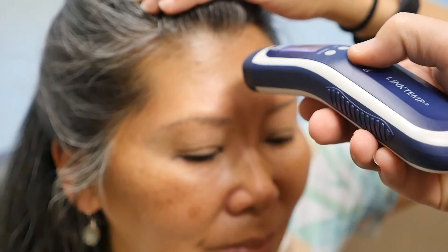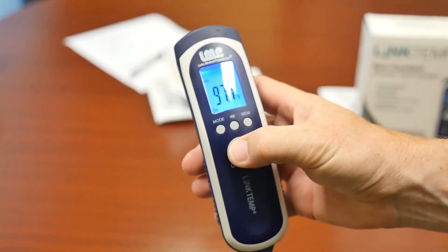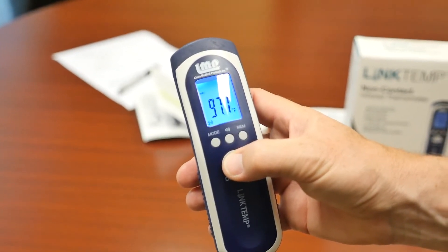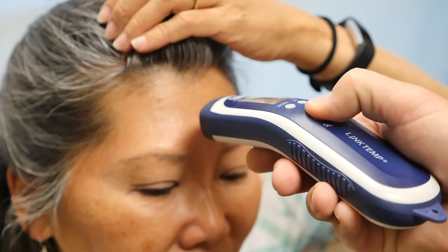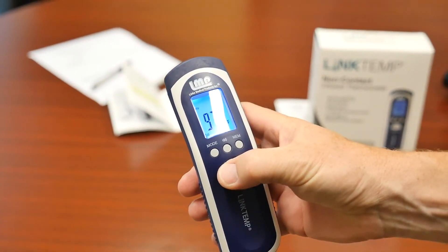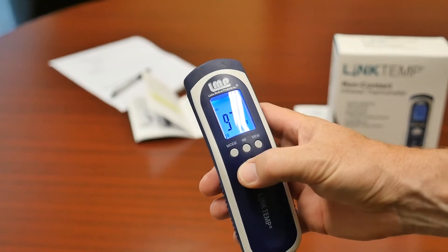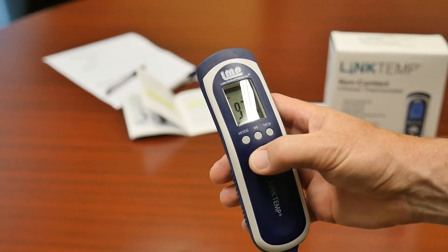Press the on/scan button to take a measurement. A measurement will instantly be displayed on the LCD screen. It's important to allow 3 to 5 seconds between measurements. Your body temperature is 97.7 degrees Fahrenheit. When you're done taking measurements, the thermometer will automatically turn off after 30 seconds of inactivity.